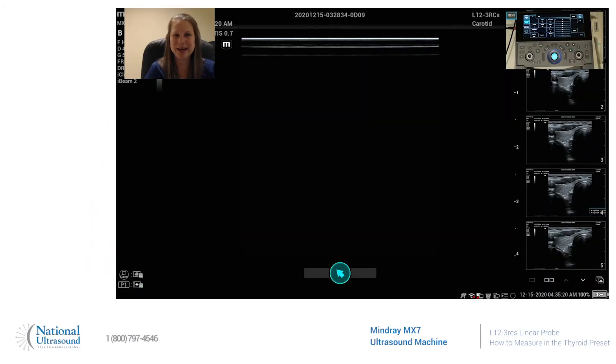Hi, my name is Jackie Klebeck. I've been a registered cardiac vascular and general sonographer for eight years. I'm here today at National Ultrasound on a Mindray MX-7 using an L12-3RCS linear probe. And today I'm going to show you how to measure while in the thyroid preset.